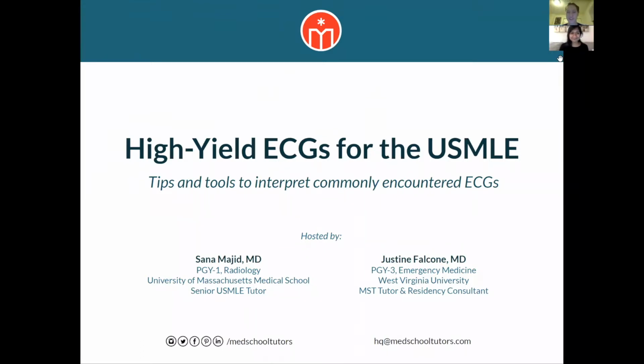We are very excited to be talking to you tonight about some high yield EKG findings, how to interpret them, and more importantly, what you need to know to crush your boards in terms of EKGs.